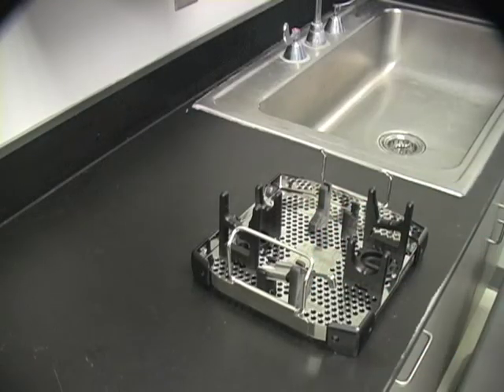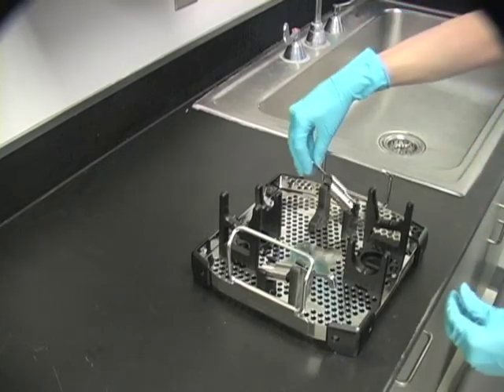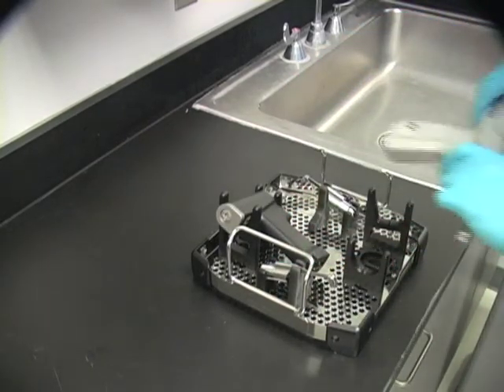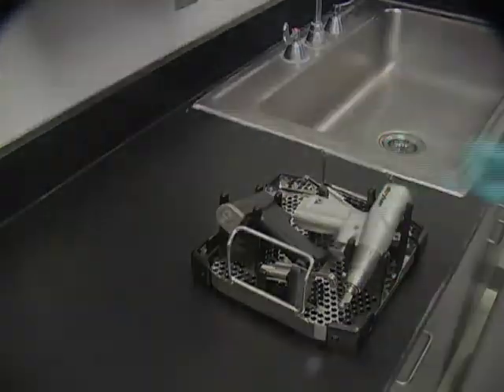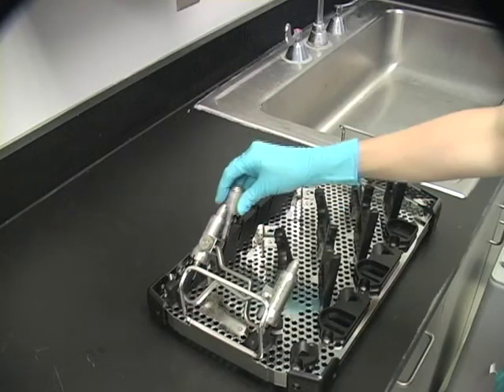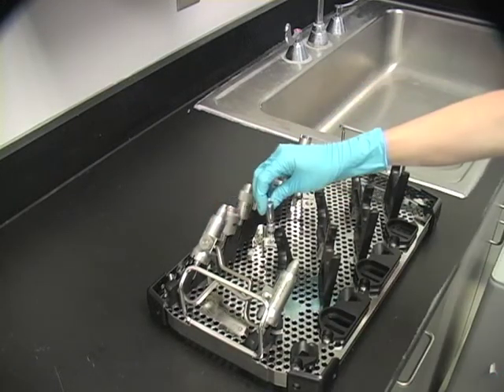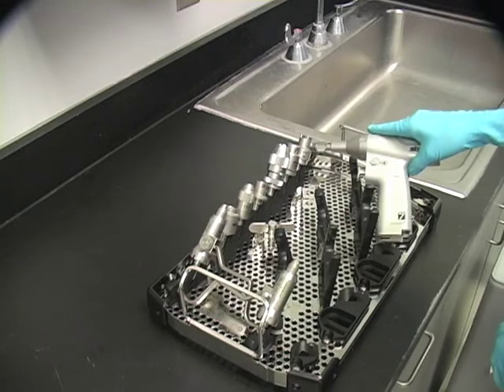The sternum sabo case can hold a sternum saw and a sabo sagittal saw as well as two sternum guards. The three handpiece sterilization case can hold up to six attachments, including two chuck keys, two collets, and three handpieces.